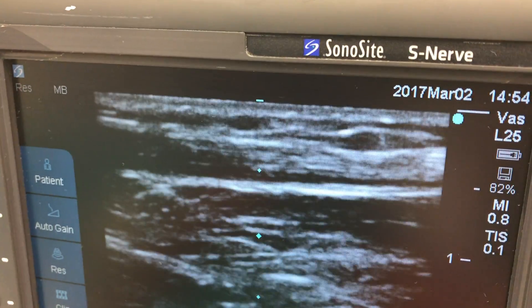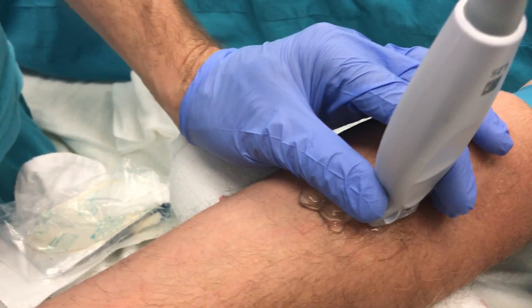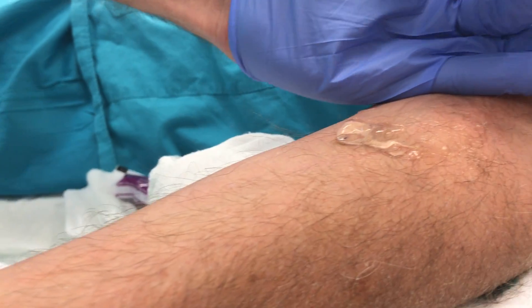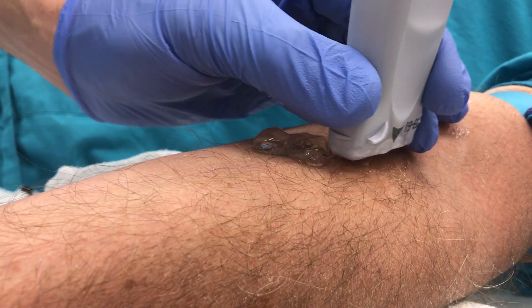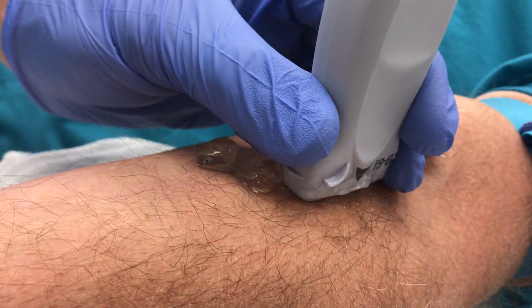If you just have a look at what my hand's doing on the screen here. To do this technique, it's really critical to hold the probe very stable and very light. I'm holding really low on the probe, resting my hand on the patient's arm. I'm going to just hover the probe on the skin, barely touching, moving in one axis at a time.